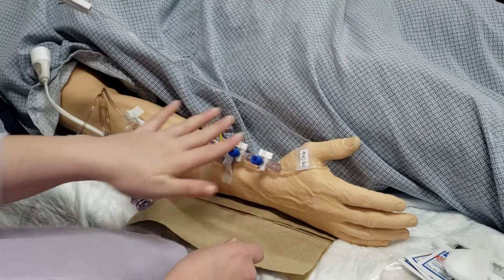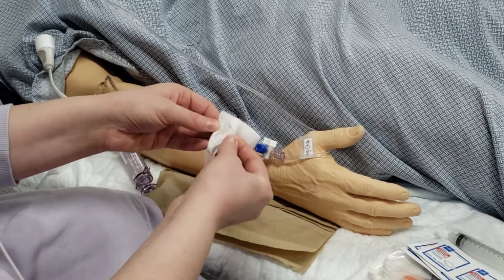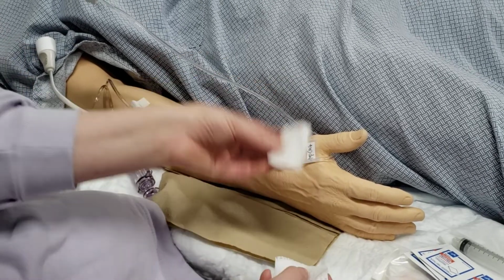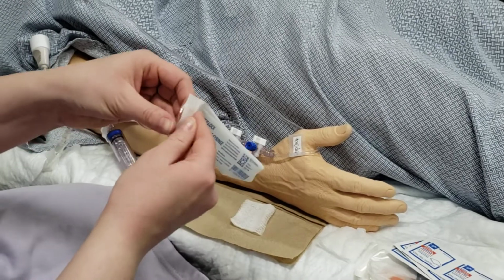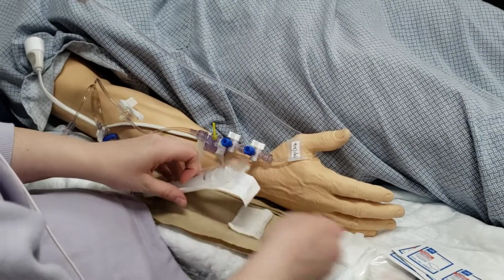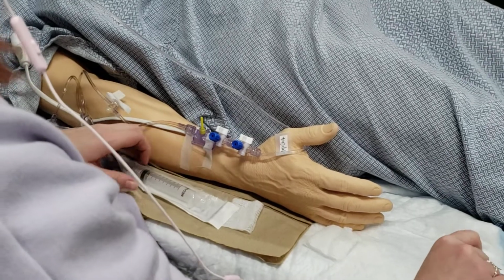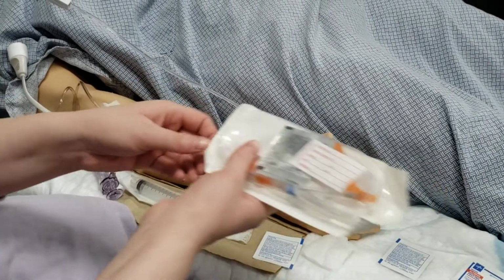We'll start with the stopcock setup. We'll take our gauze, our syringe, I open it up just a little bit, our alcohol, and our blood gas kit.